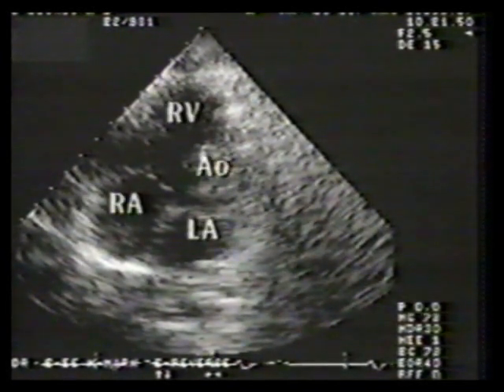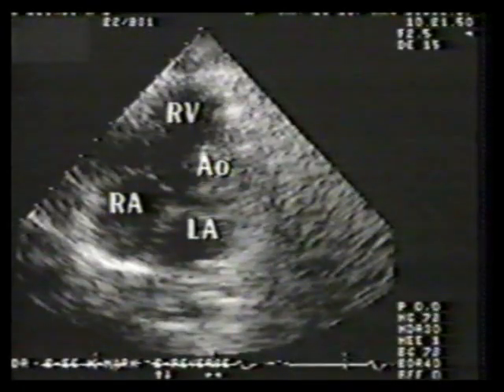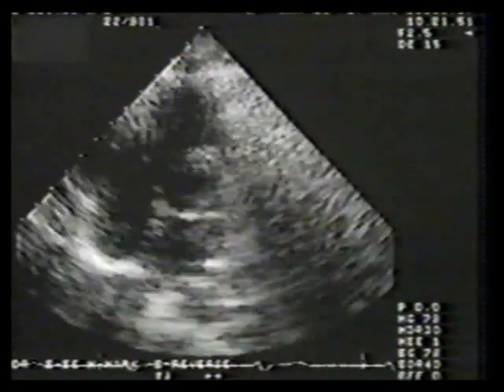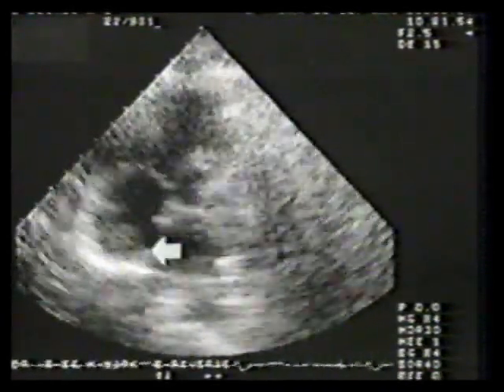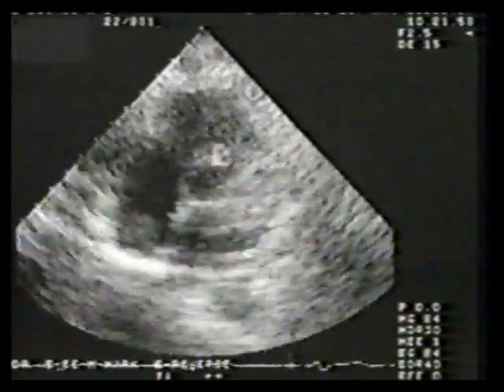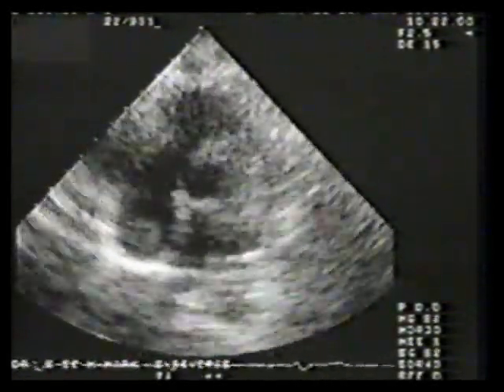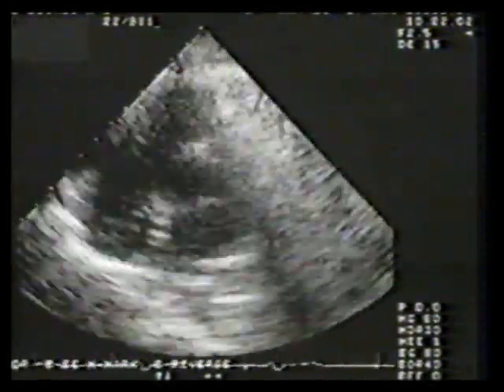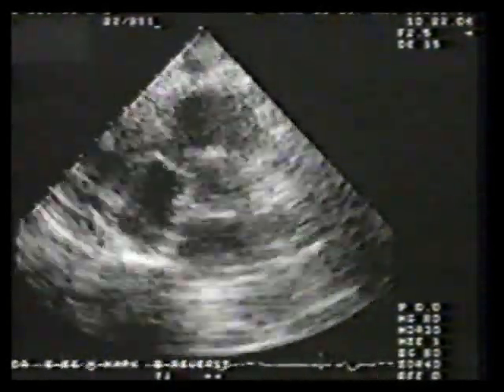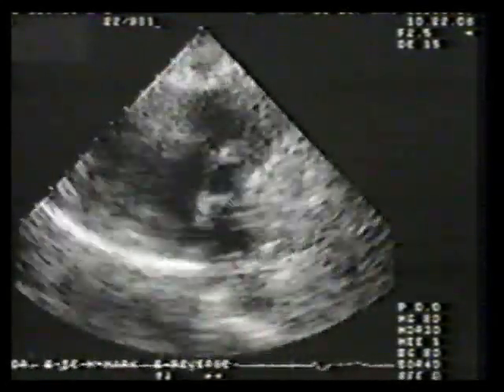This is a parasternal short-axis scan of this same patient. At age 35, she had a right atrial myxoma. At age 43, a left atrial myxoma. And now at age 45, a question of a small pedunculated mass in the right atrium. Note that on this parasternal scan, the tumor is not adequately elucidated, and thus transesophageal echocardiography is to be performed to further delineate this questionable recurrent atrial myxoma.